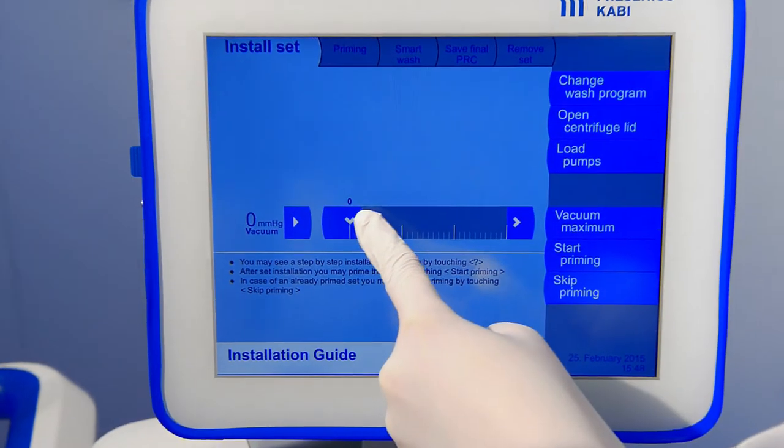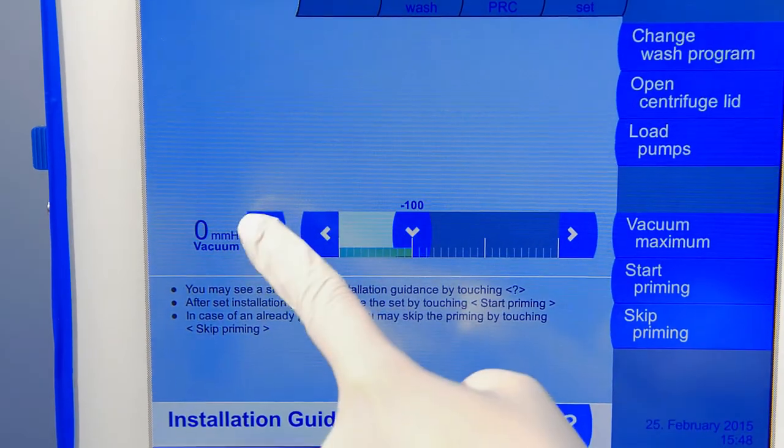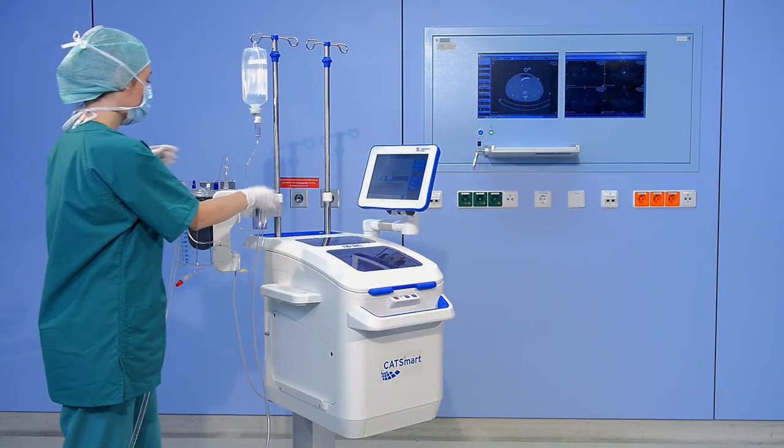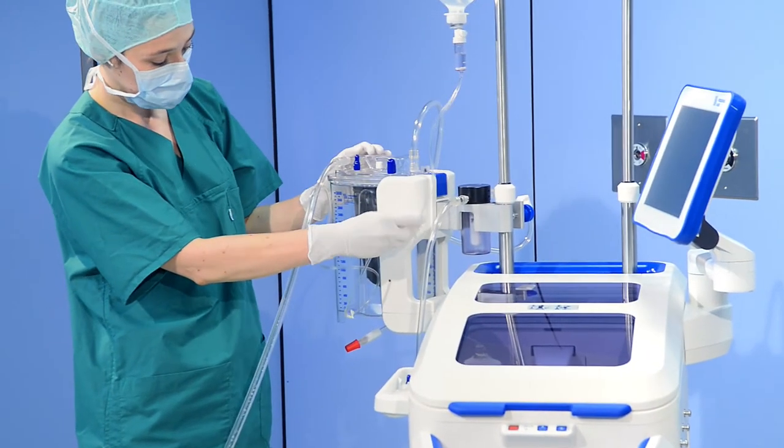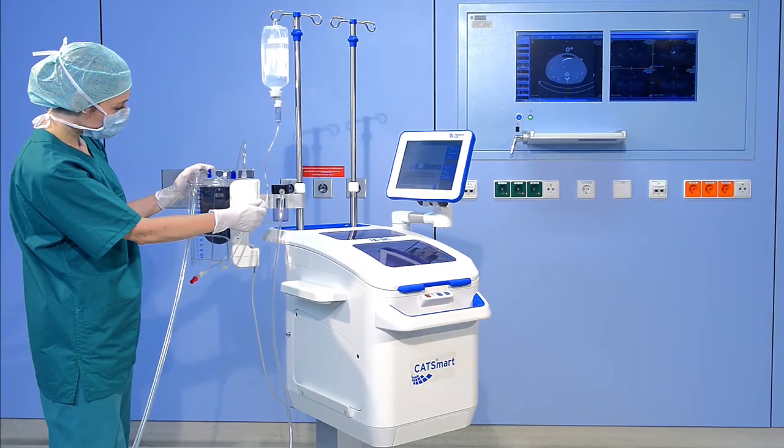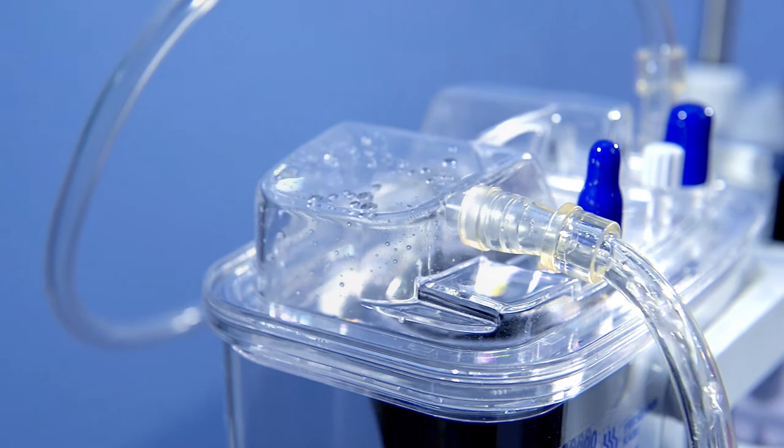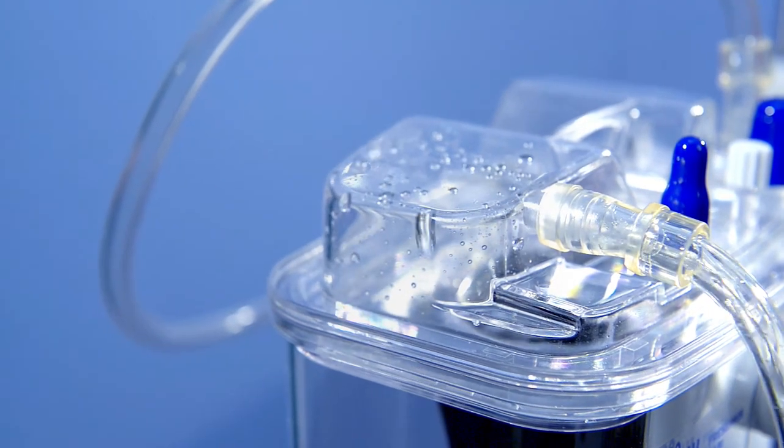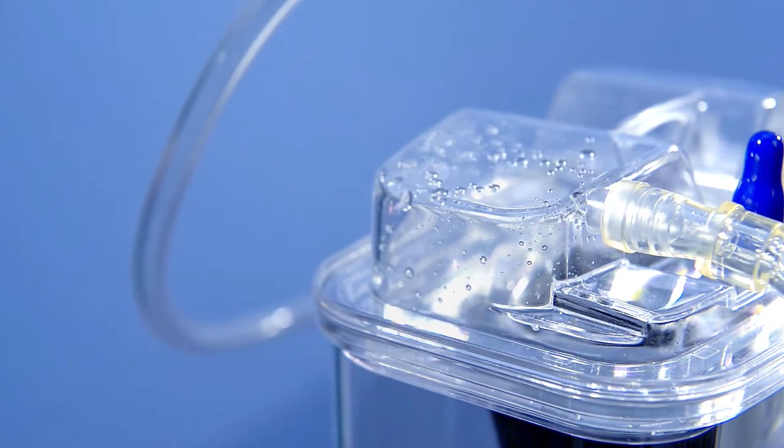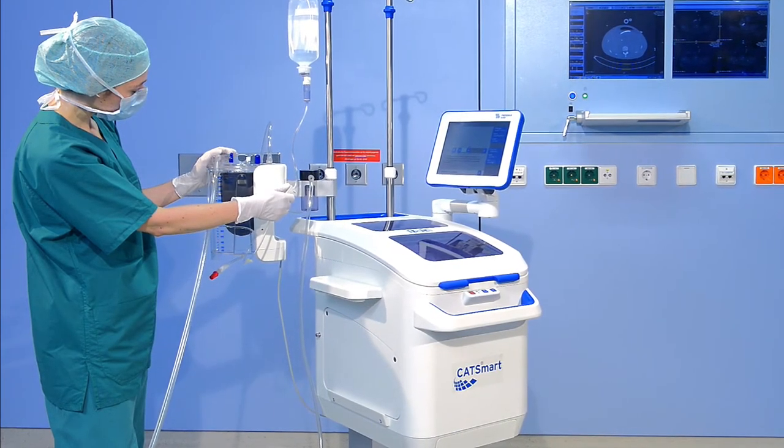Adjust vacuum via the touch screen to minus 100 mm mercury. When suction has begun, open the roller clamp below the drip chamber and prime the suction line and filter with 250 milliliters of anticoagulant. We recommend heparin. Afterward, adjust the flow to 60 drops per minute.